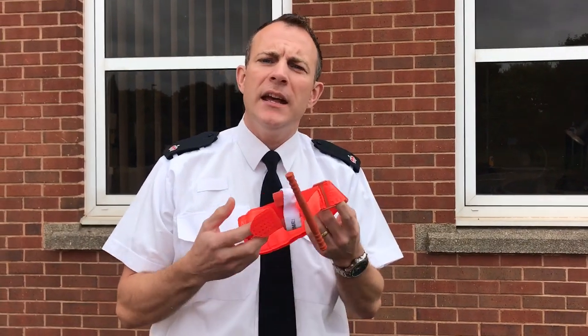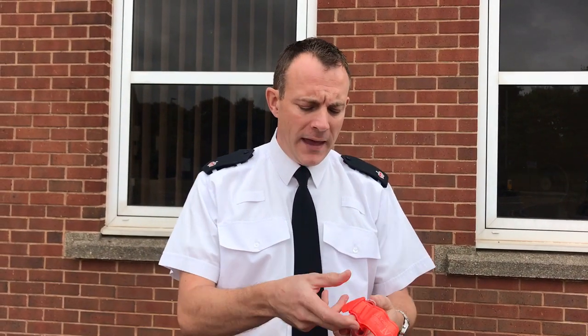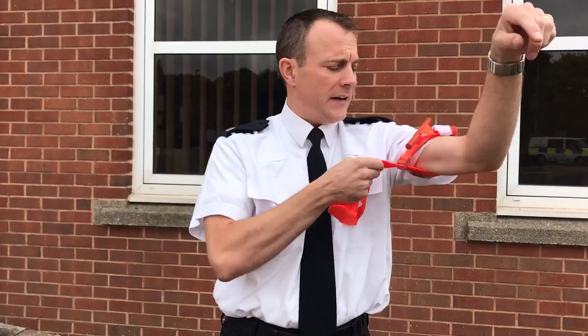This is a combat application tourniquet, similar to the ones which are going to be given to frontline officers and PCSOs. We've already started training on them. It's very easy to apply to an injured member of public who might be on the floor with a catastrophic bleed, and we've also chosen a model that officers can apply to themselves very quickly if they need to.